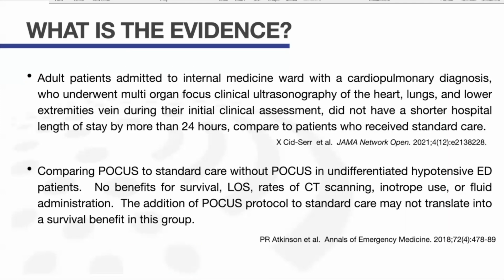However, it does help in your assessment to get an early diagnosis, and hence continue management of the patient and also monitor the management of the patient using POCUS itself.